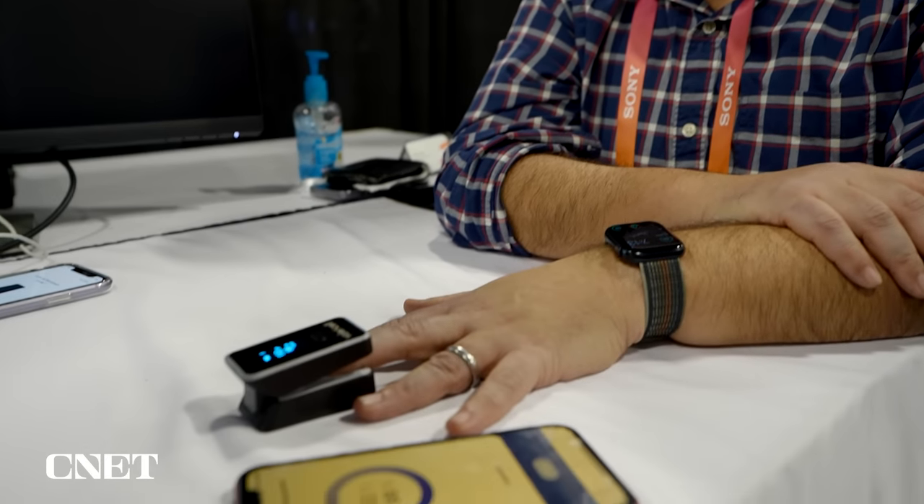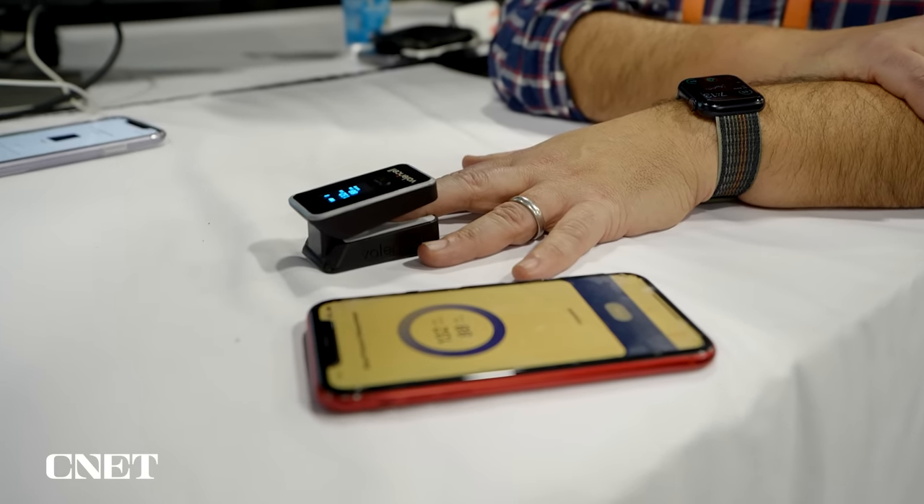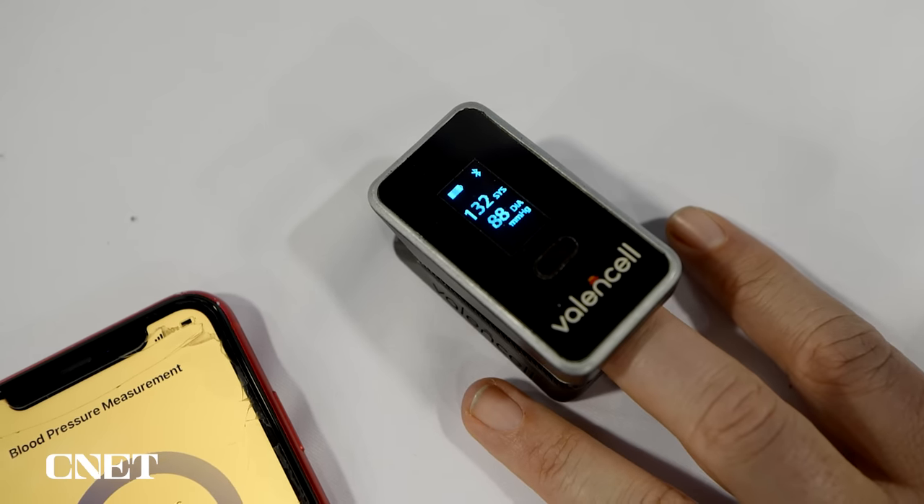I took a reading in a very crowded CES in Las Vegas — not an ideal situation for blood pressure. I'm dehydrated, I was wearing a mask, I was feeling stressed. Once it took a measurement, which again took about 30 seconds, I got to see that lo and behold, blood pressure was high.